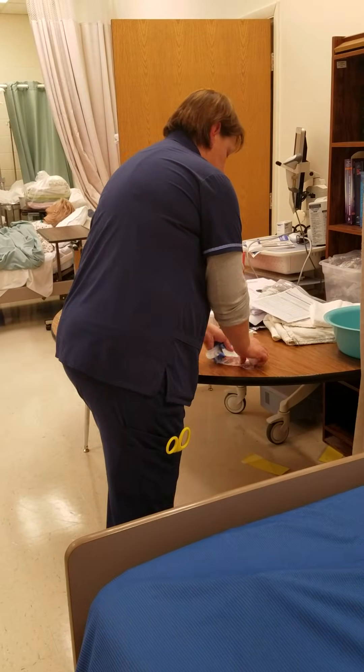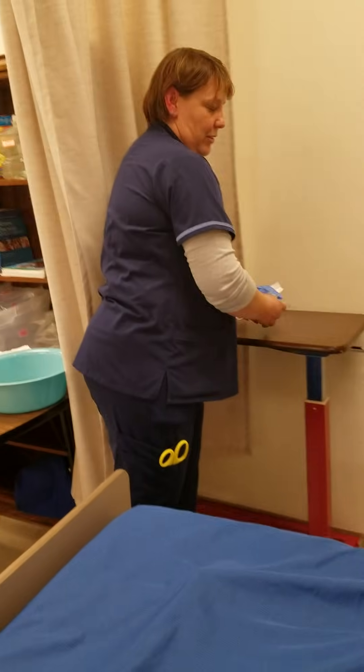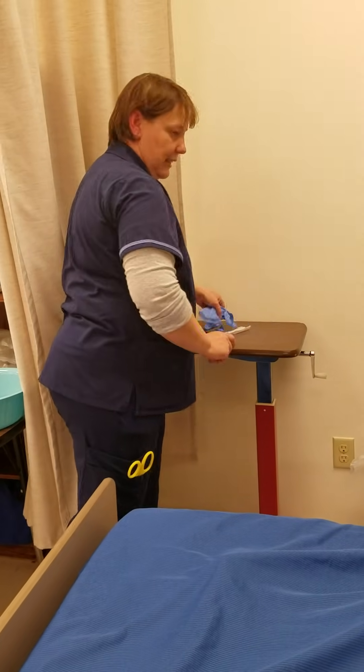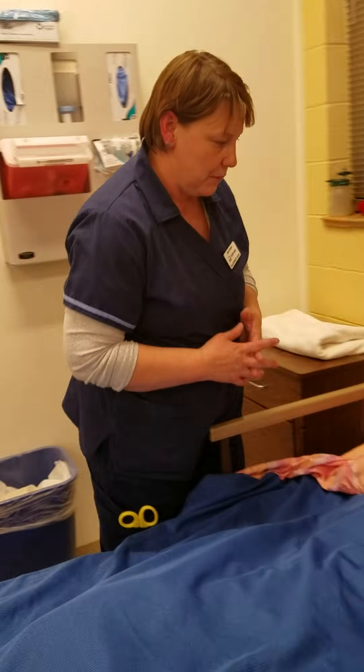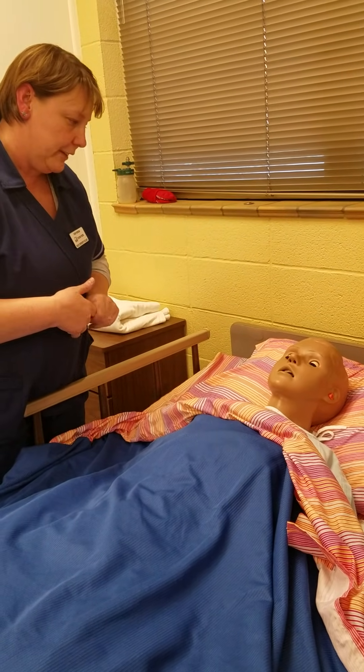I'm gathering everything that I need to go in. Hi Jose, it's Tony again, student nurse with MCC. The doc has ordered a urine sample to be collected from your catheter, so I'm just going to go ahead and do that.